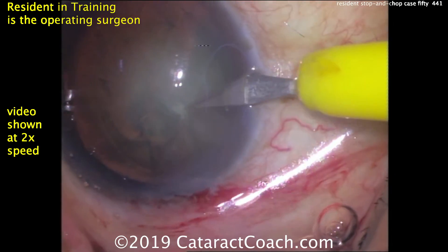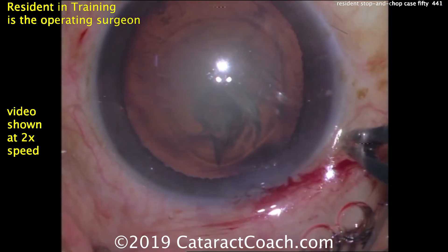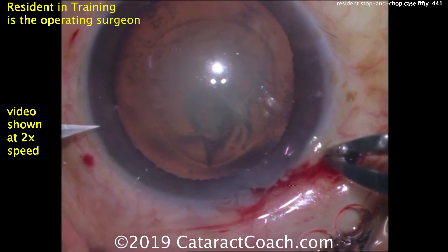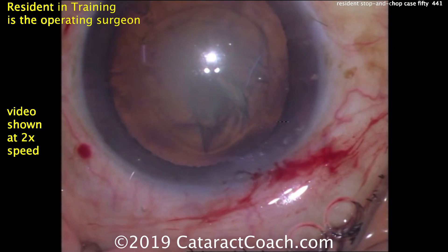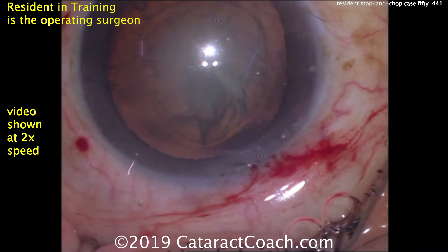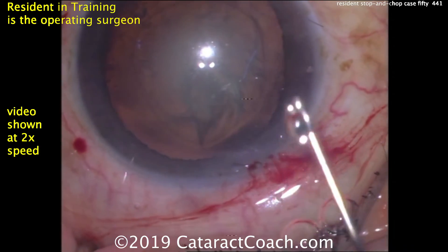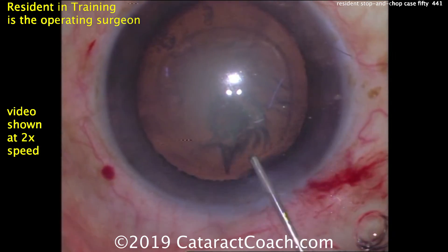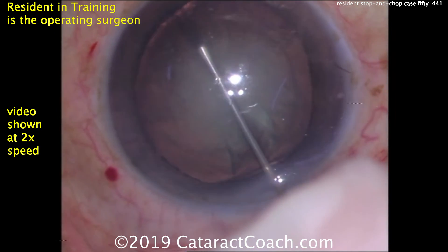Now making paracentesis incisions on either side — those will be used for bimanual irrigation aspiration, so again those are about 180 degrees apart. Those look pretty good, but I'd like those to also barely nick the limbal vessels, because that would give better long-term sealing. Now time for some hydrodissection with balanced salt solution.